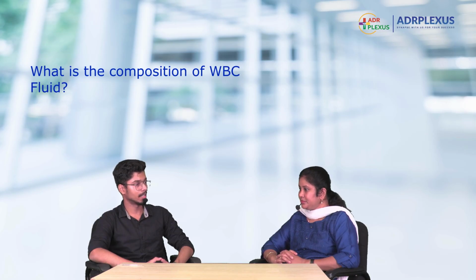So 1% glacial acetic acid, Gentian violet, ma'am. Gentian violet. Okay, that's what I wanted to emphasize. It should not be pronounced as Genitan violet or Genesian blue. Different colors students used to say it, okay? Only Gentian violet. Yes, ma'am. Okay. Then distilled water.